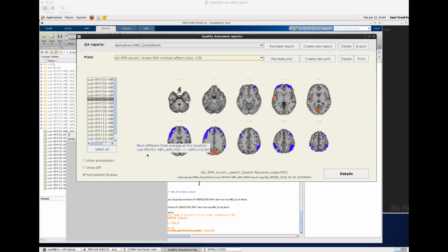Would it make sense to try it with just this subject first to see if it works? Right, exactly. You could try it just for this individual subject, regenerate the plot, and see whether that helps. And if you find a combination that works, then run that combination for every subject and look at every other subject to make sure it didn't negatively affect them. If both of these things work, then you're happy to move on. Okay, all right, I'll try that.